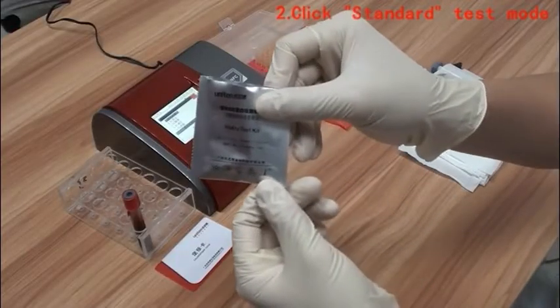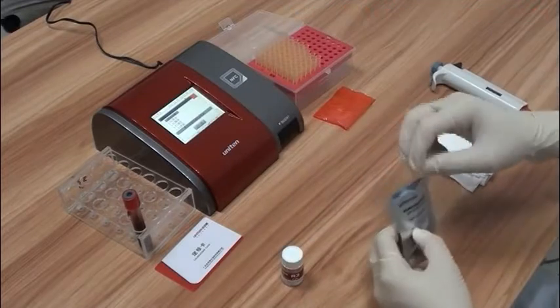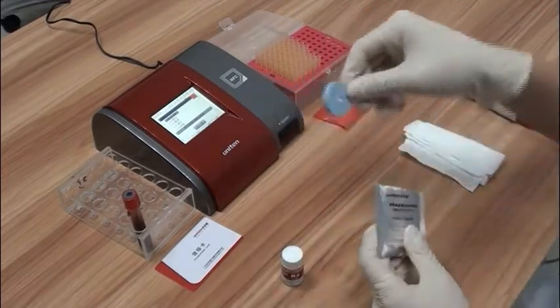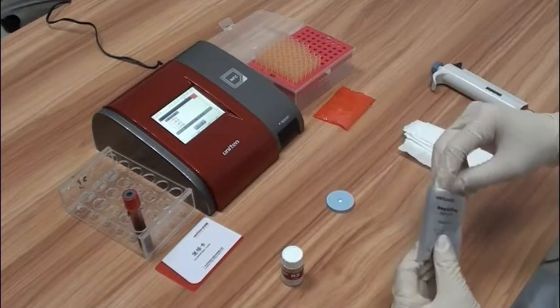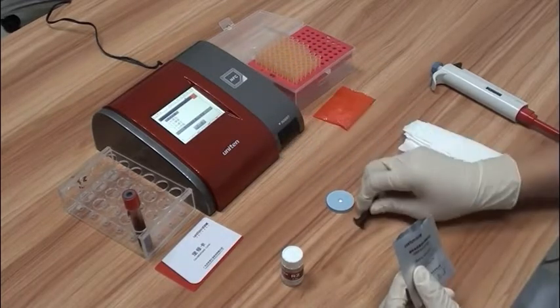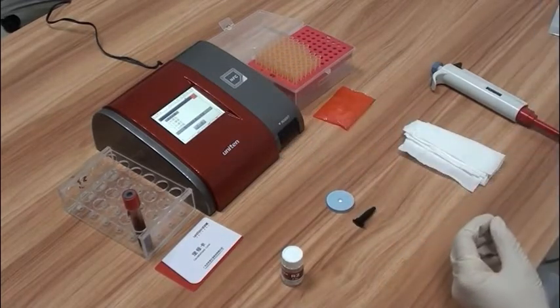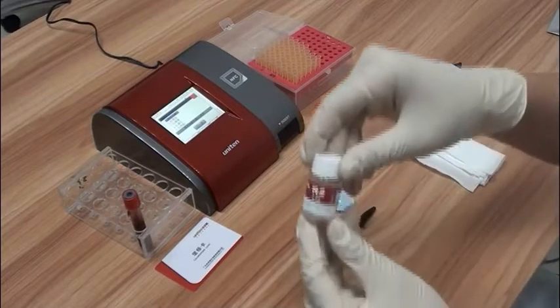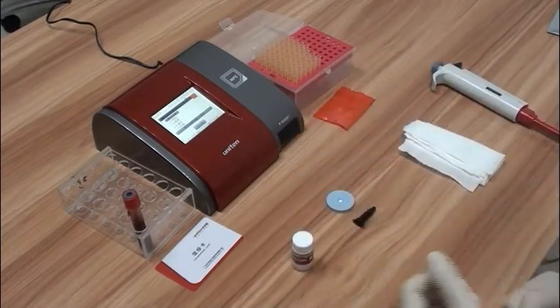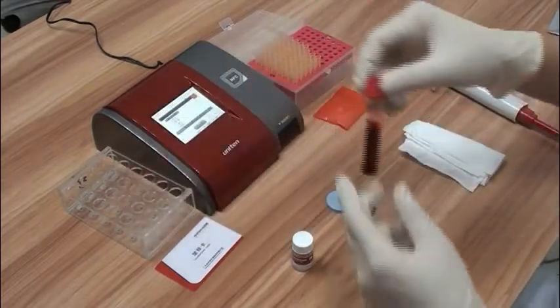Test kit should be balanced to room temperature before a test. Mix the sample.